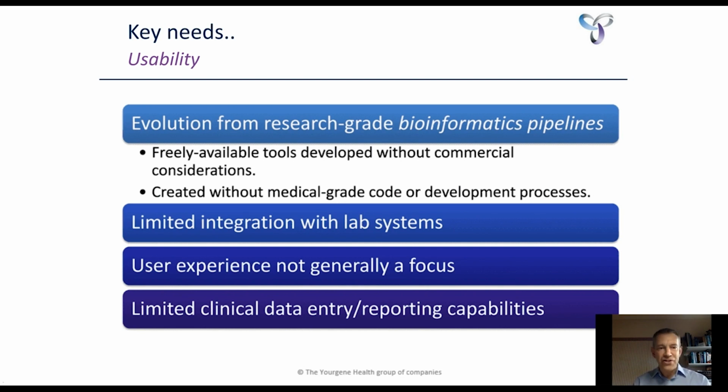But they're not necessarily suited to commercial operational lab environments because they were normally created without medical grade code or development processes. So that also means that very often there was a limited level of integration with lab systems.